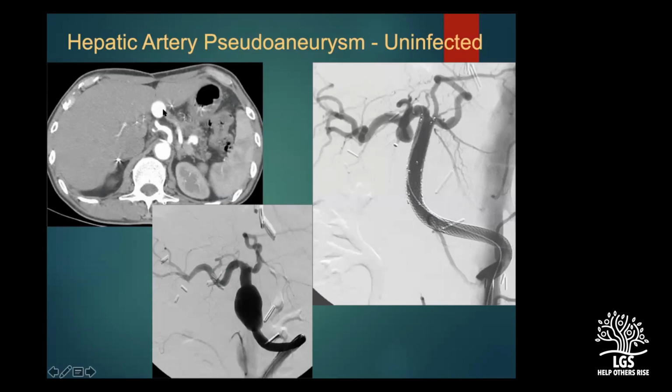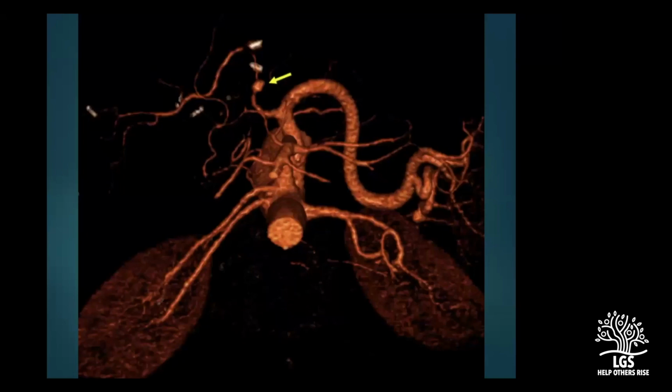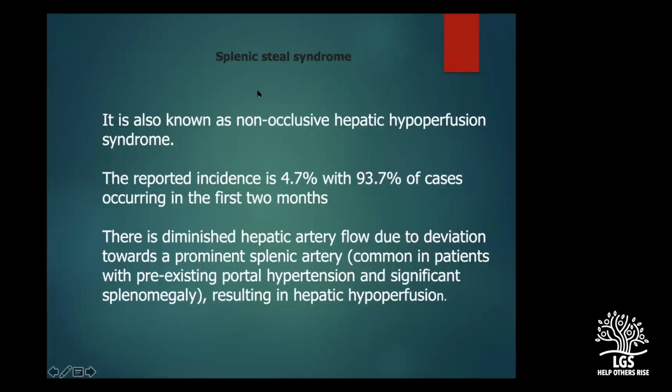So we can also get inside this hepatic artery pseudoaneurysm percutaneously using CT guidance or ultrasound guidance. Transhepatically, we can get inside this particular pseudoaneurysm and make it completely thrombosed. That's a very simple thing to do rather than putting in a stent. It can be a very expensive job if you have to put a covered graft. So this is again one simple thing that we can do using a thrombin injection. That's a reconstructed image which shows a pseudoaneurysm in the hepatic artery.